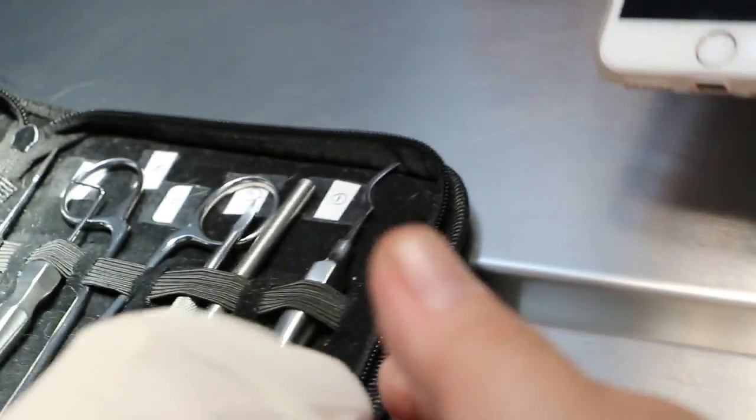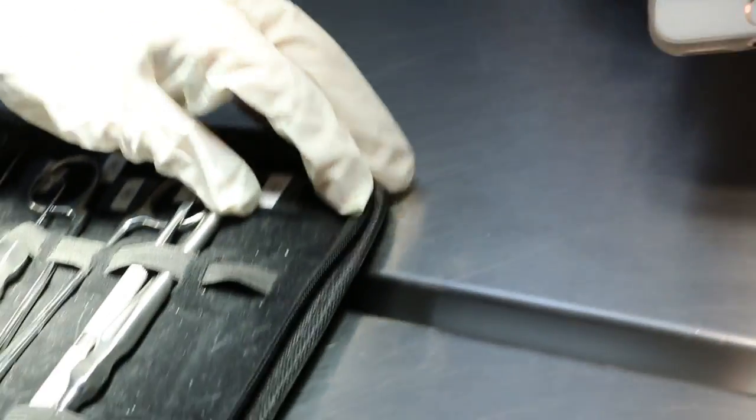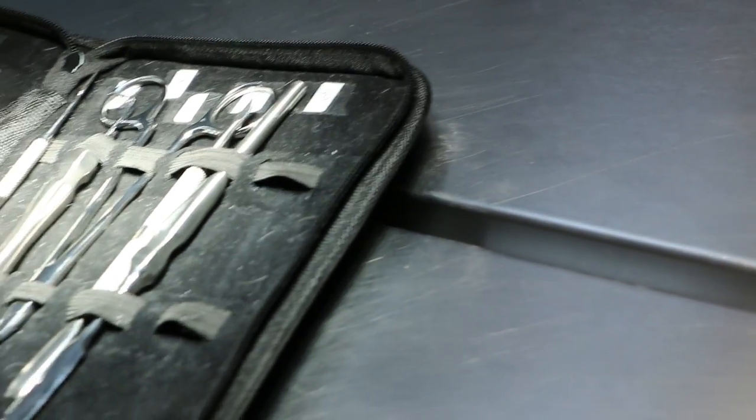Now we open up to show the use of each individual instrument.